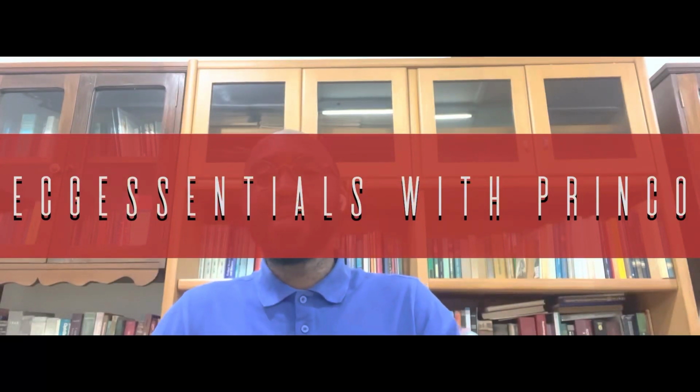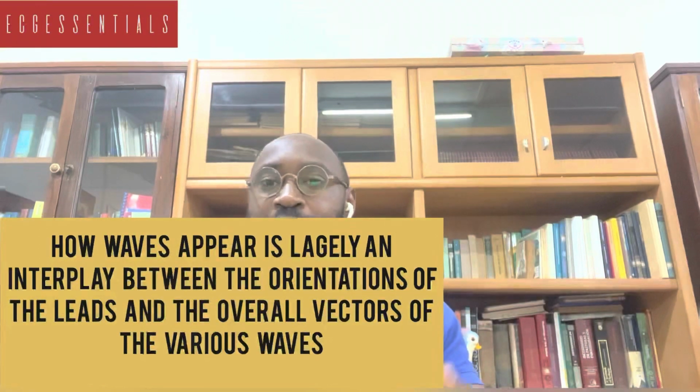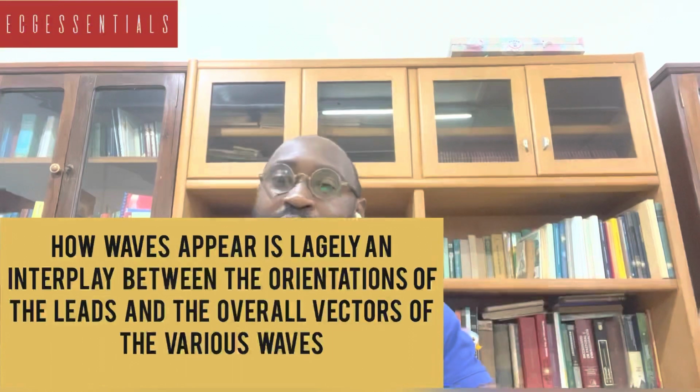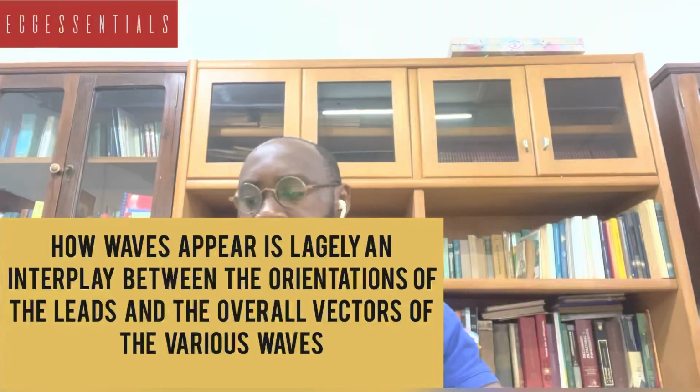Ladies and gentlemen, having discussed our electrodes and our leads, in essence, our electrical cameras, we are ready to discuss our waves in better context, because the basis of this discussion is just an interplay between the angle of orientation of the leads that we have discussed and, of course, the direction of these vectors of the various waves and how they are directed to these leads.